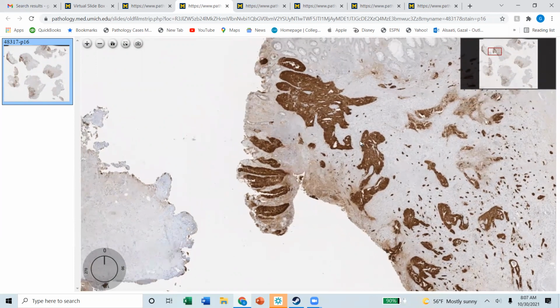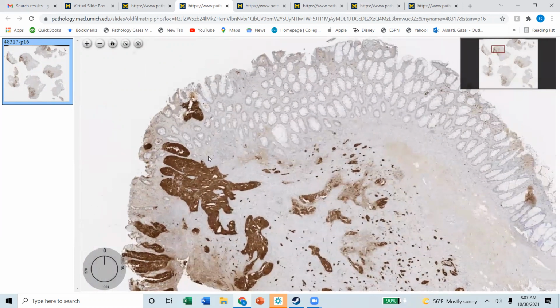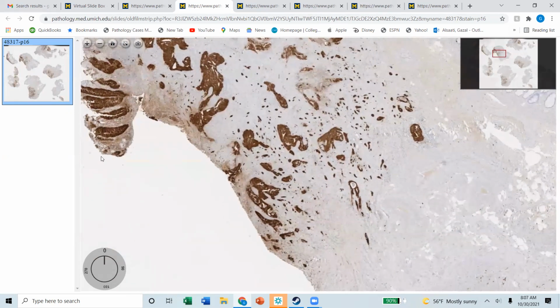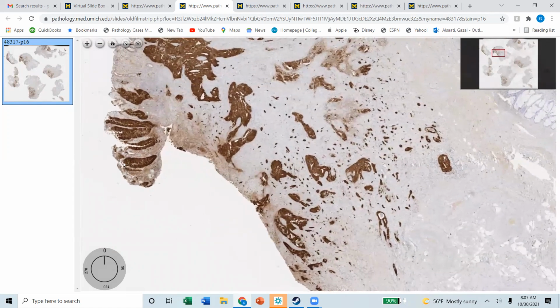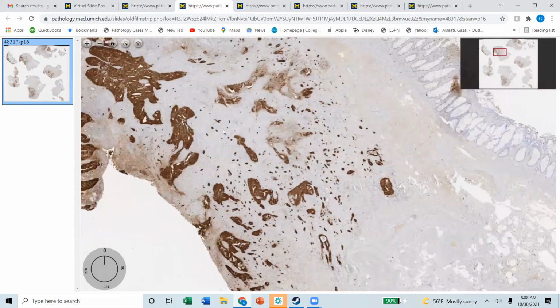That's weird, but the nice thing about it is, look at the difference between the HPV associated glandular and the normal. See how the HPV probably started in the squamous, and then crawled up into the glands and affected the glands. The glands were so naive, they became dysplastic, and then they became carcinoma, adenocarcinoma.